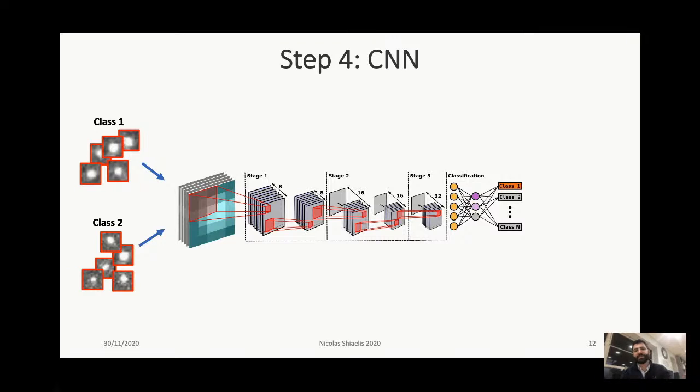So once all the cycles, all the epochs, are complete, we end up with a trained model, which is actually reusable. So you only need to train once, and once you have your trained model, you don't have to retrain. The first time I trained a network was back in March, and I tried one about a week ago. So about 6 months after the first training, it still works. You don't need to retrain. You can still predict if the sample is positive or negative.